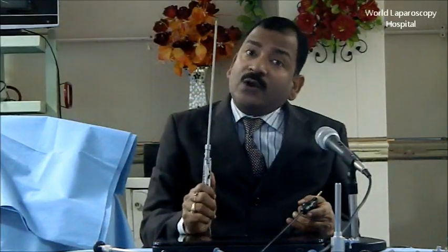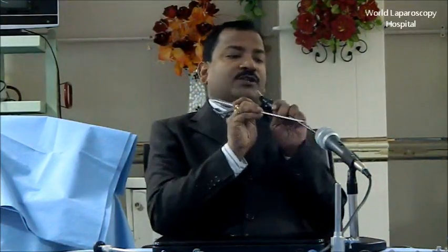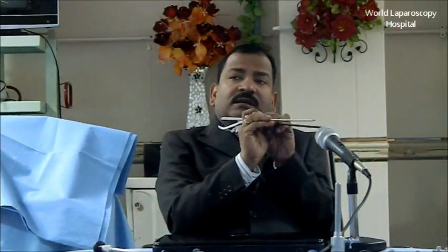In open surgery, it doesn't matter. Any time I can decrease, any time I can increase. But in laparoscopy, it depends upon where your port was put. If your port is wrong, your manipulation angle throughout the surgery is wrong. Isn't it? Suppose this is the fundus of the uterus, and I put the two ports just on the top here. Now this manipulation angle is fixed throughout the surgery. I cannot increase or decrease. Or if I put ports at both anterior superior iliac spines on either side, now this is fixed.